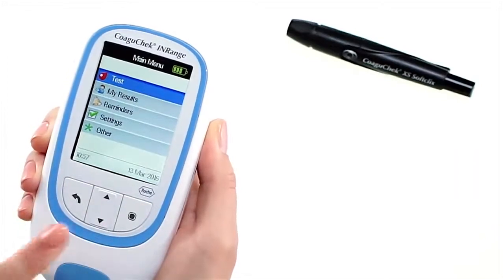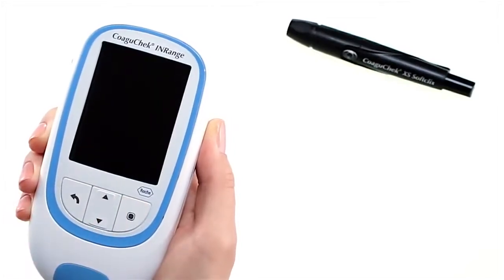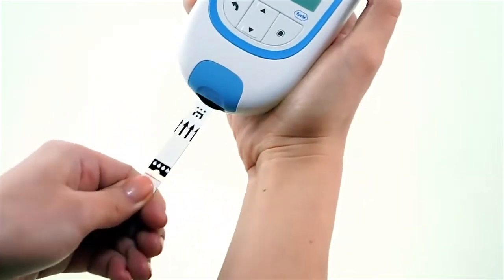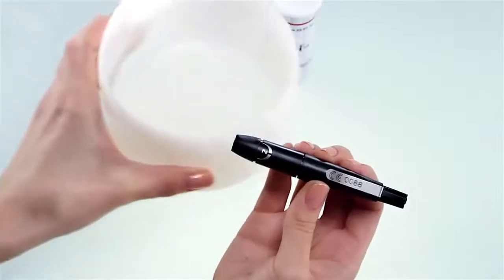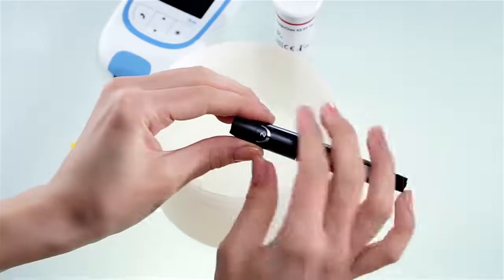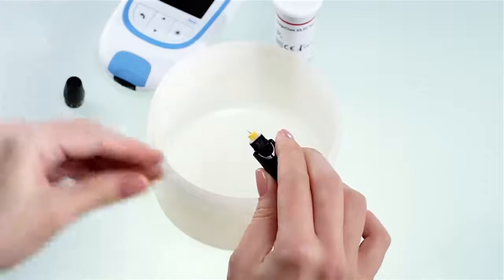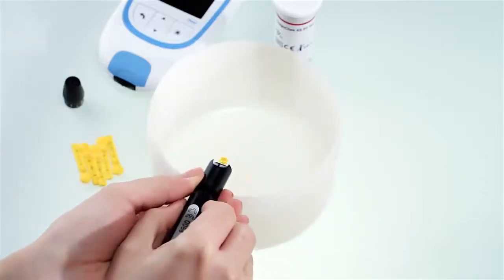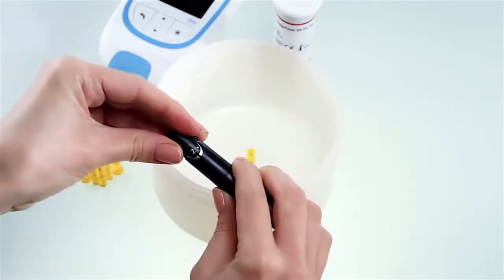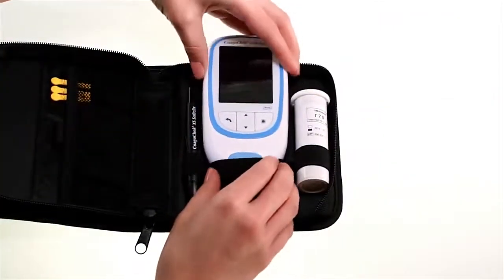Press and hold the enter button until the meter turns off. Now two important final steps. First, dispose of the used test strips in your regular household waste. Then carefully dispose of the used lancet so that it cannot cause injury to yourself or others. Use a sturdy sharps container with lid. Remove the cap and point the lancing device into the sharps container and slide the ejector forward as shown. Then place the cap back on the lancing device. Remember to store everything you need in the carrying case for next time you need to test.